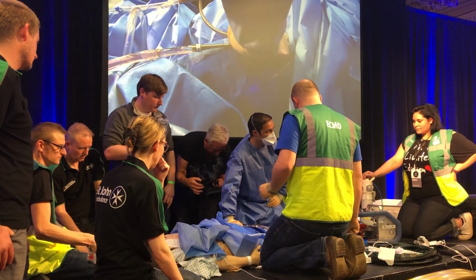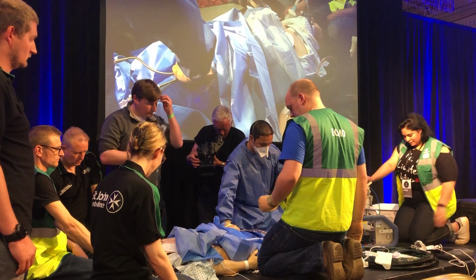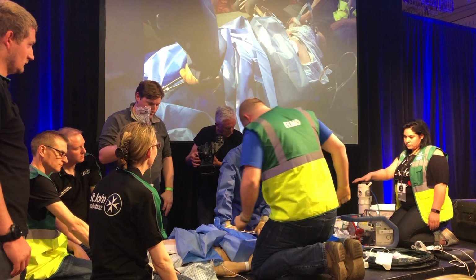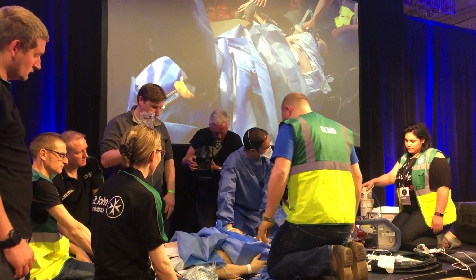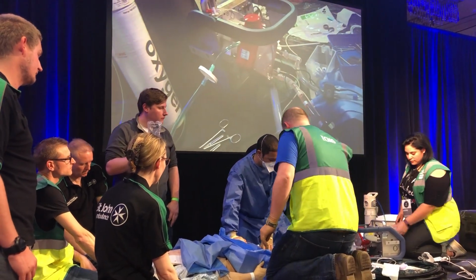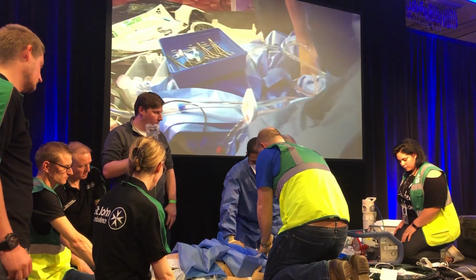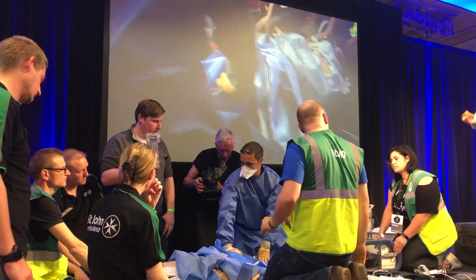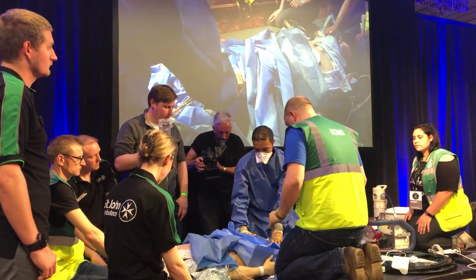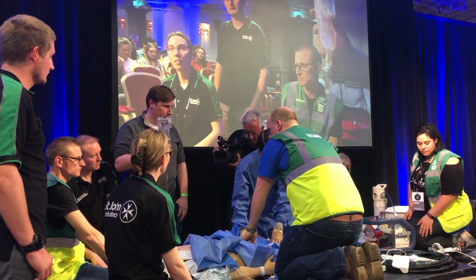And so this patient at this stage is getting full perfusion of brain, heart most importantly, and then lung, kidney, and everything else. So at this point we have a more relaxed, still urgency but no haste, a nice relaxing packaging. Someone will always stay on the pipes, secure them, sutures, stick them all down, make sure we're happy with the battery, make sure we've got oxygen, and go through the post-ECMO checks. Then we would be getting onto the ambulance and heading to Brighton, where we would have a look at the coronaries and make sure the leg's okay. And then we would take the patient back to Barts onto our ECMO unit.